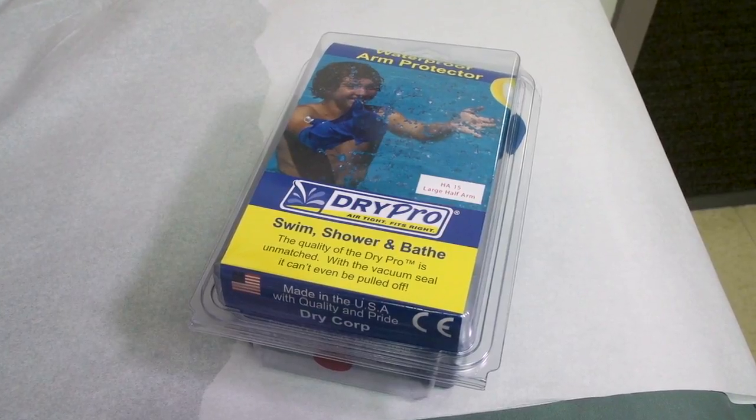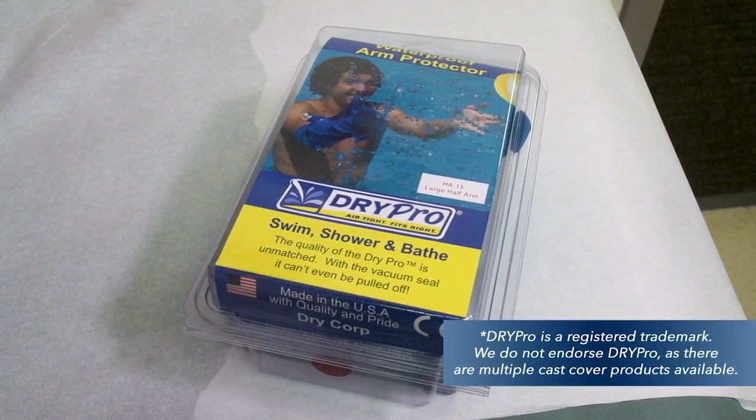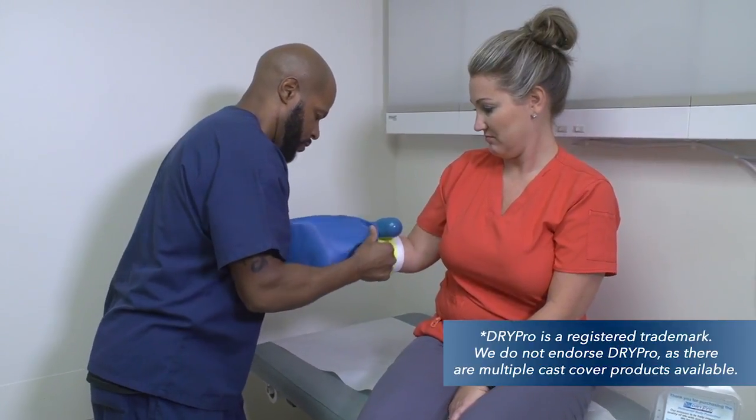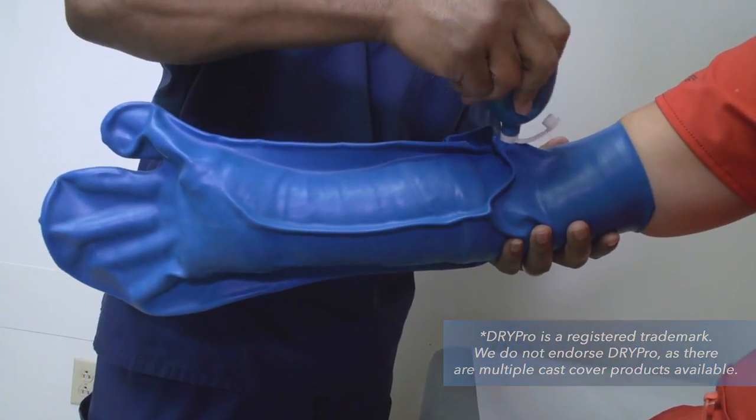Another option to keep your cast dry is to use a product such as DryPro, which is available for purchase through our office. This product uses a vacuum seal to prevent water from getting into the cast.